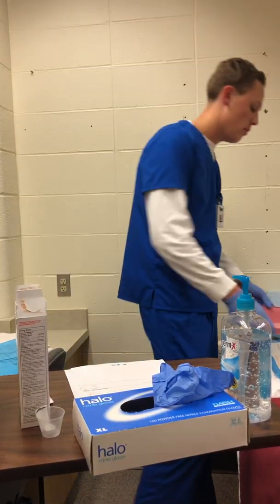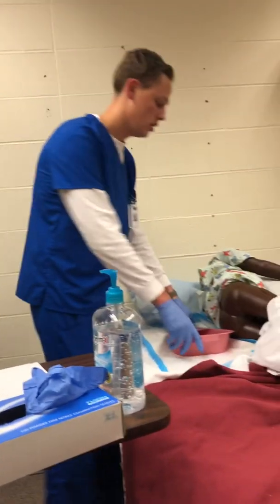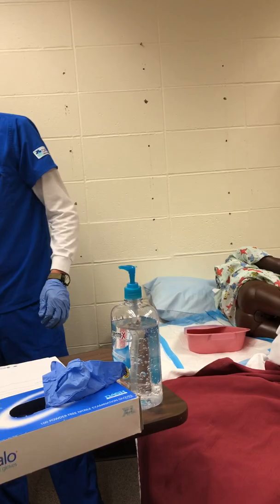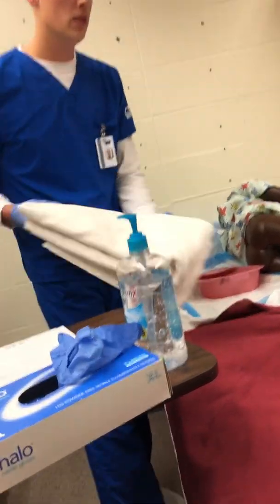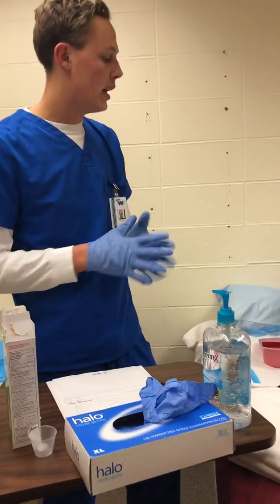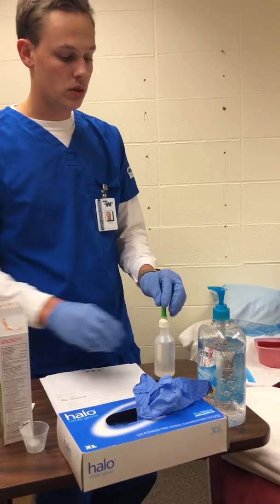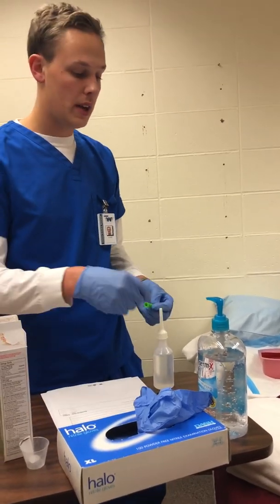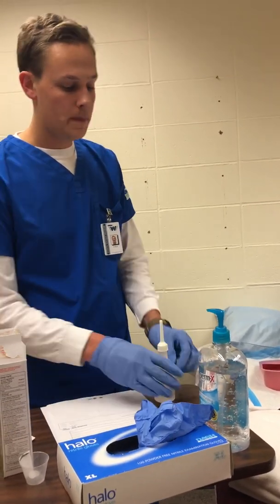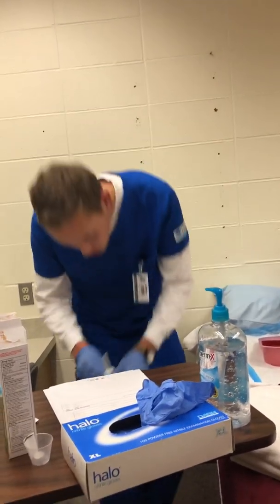I'll have the bedpan down, and then I'll also provide a bath blanket for later on. And then I'll perform hand hygiene once I enter the patient's room, put on clean gloves, and then I will remove the tip of the enema, administer the extra lube to it, and then I'll verbalize to the patient that we're about to start.